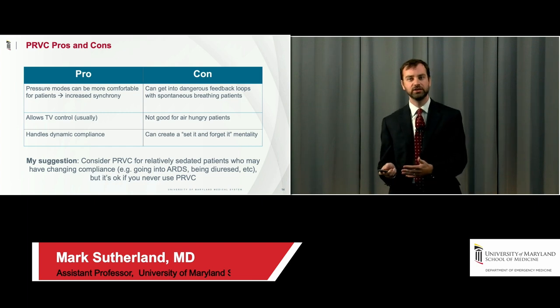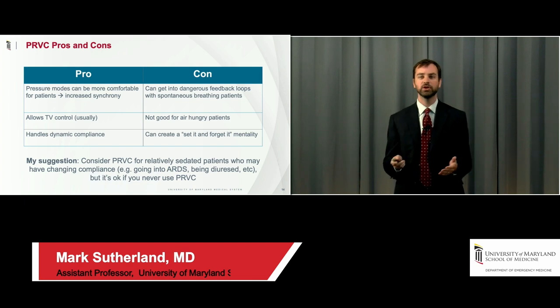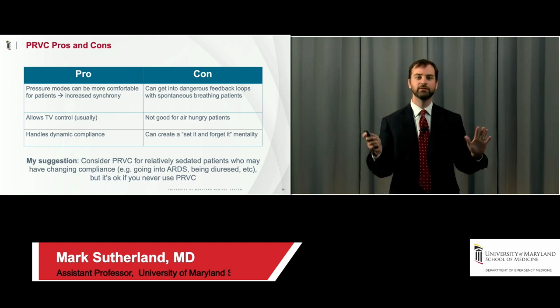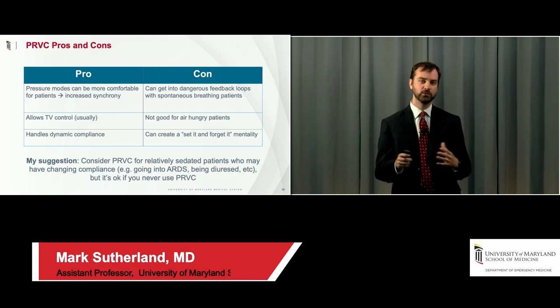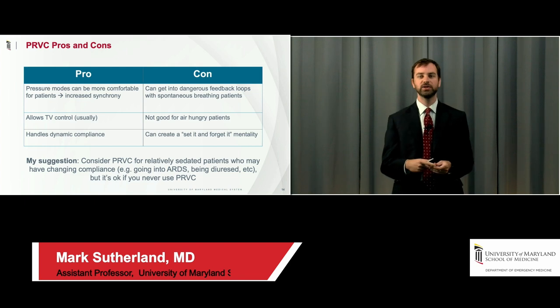Downsides of PRVC: you can get into these feedback loops of the vicious cycle I just talked about. For that reason, it's not really good for air-hungry patients. And then I think it can create this kind of set-it-and-forget-it mentality where we set PRVC and we walk away.